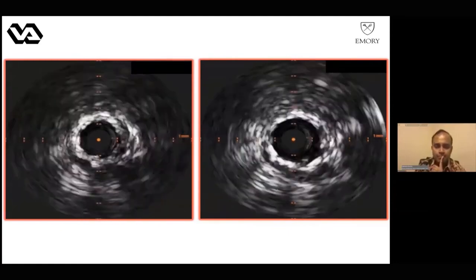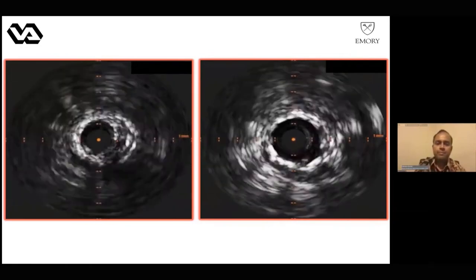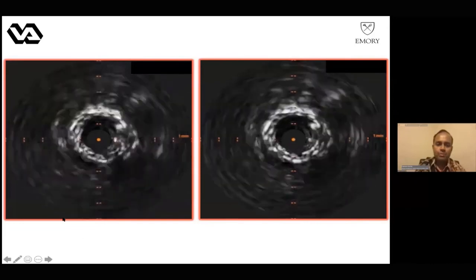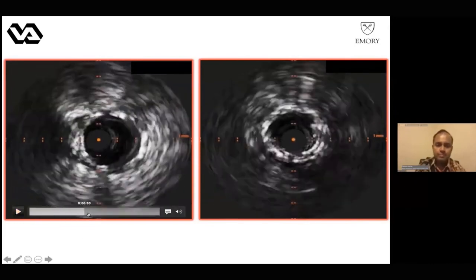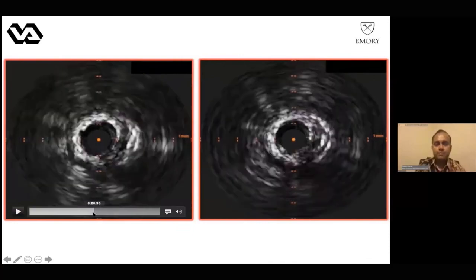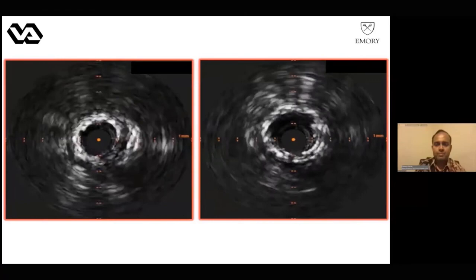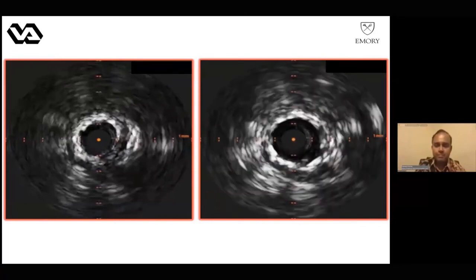Sure. Even a short run, it's a very clear message. It's a very small stent area, and it looks like almost the same size as the IVUS catheter. So this is a Volcano IVUS catheter. The stent area could be less than 2 square millimeters, which is super, super small. And we have to identify what is the reason.